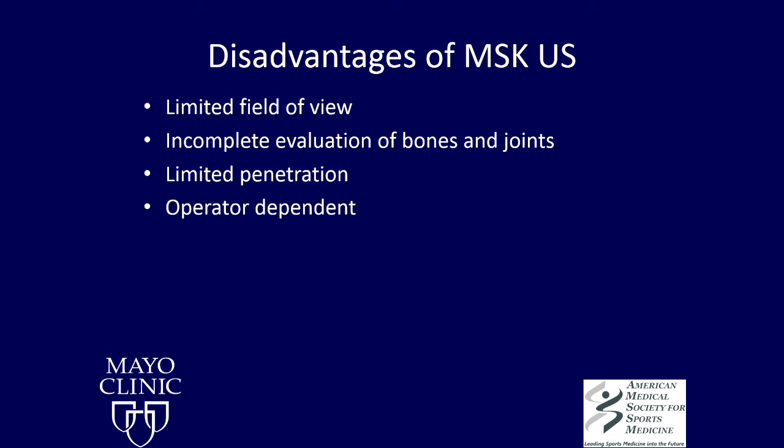And while an MRI or a CT scan, or even an X-ray for that matter, really takes an image and is interpreted nowadays by a computer generated process, with ultrasound you have to take your ultrasound probe, put it over the structure of interest, orient the probe so that the sound waves hit that structure at a right angle to its surface in order to get the image that you're looking for. And that takes time, and it makes it operator dependent because you have to learn how to do that. But anybody can learn, you just have to put the time and effort into it.